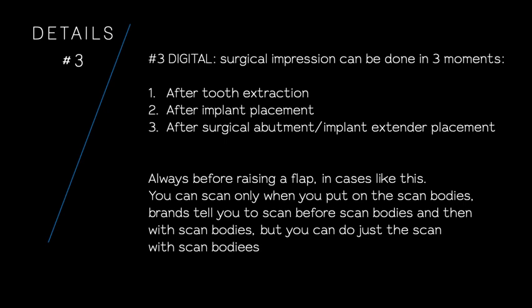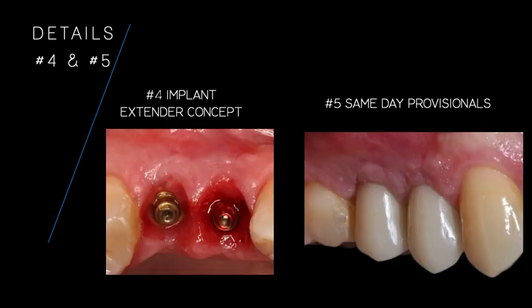I'm doing it a lot more now. So instead of doing a pre-scan of the post extraction, I do the scan with the scan bodies already on. Okay, and that's quite a thing. It's quite a detail. So now, fourth and fifth detail, implant extender concept.